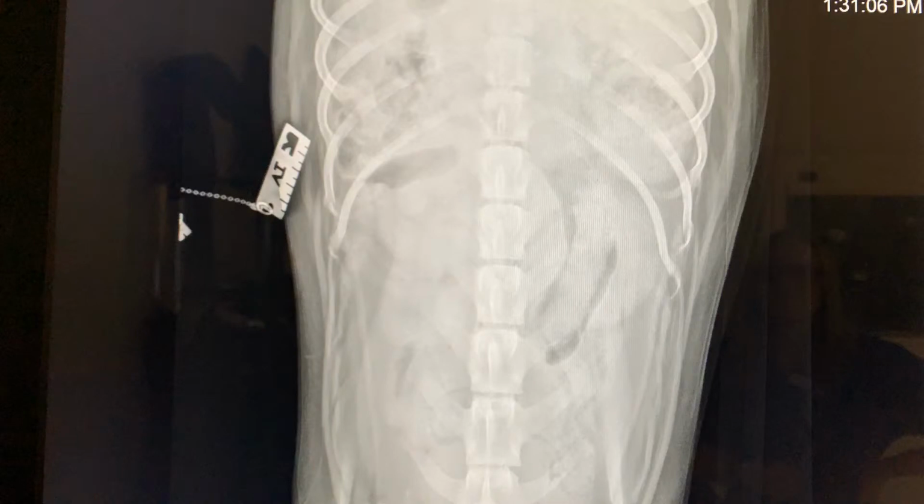Barium sulfate is not hypertonic and does not increase the intraluminal fluid. A disadvantage is slow transit time through the small bowel. Chilling the barium sulfate for an upper GI study does not speed up the transit time. However, for a lower GI study, a barium temperature between room and body temperature is more comfortable for the patient.